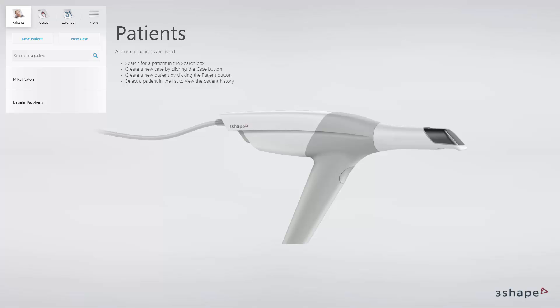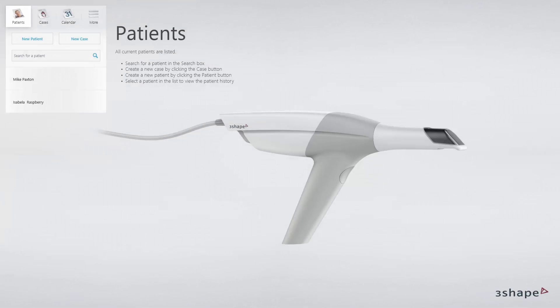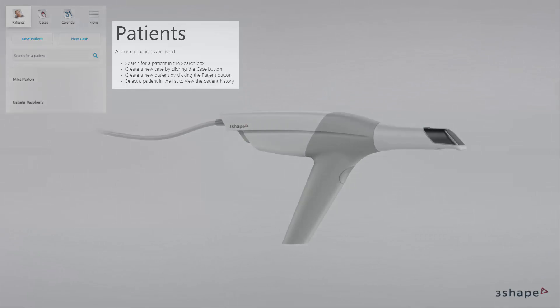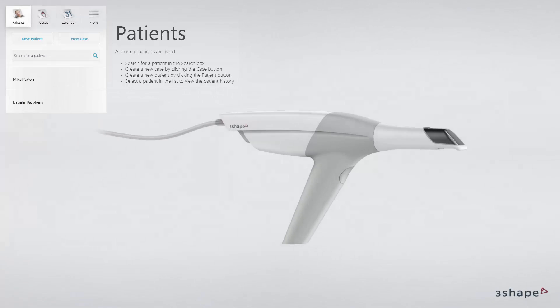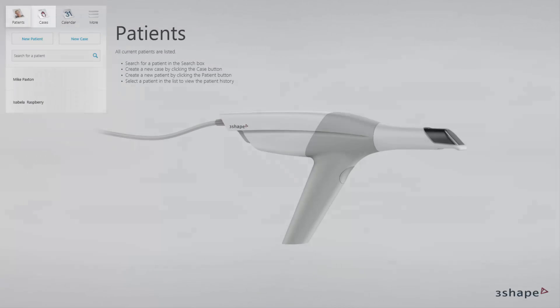The home page is the order management module, which is the first module of the software. From here you can manage your patients, cases, and orders. As a default, the patients page has been set as the home page, but you can change that in settings, depending on your preference, into the case page or calendar page.